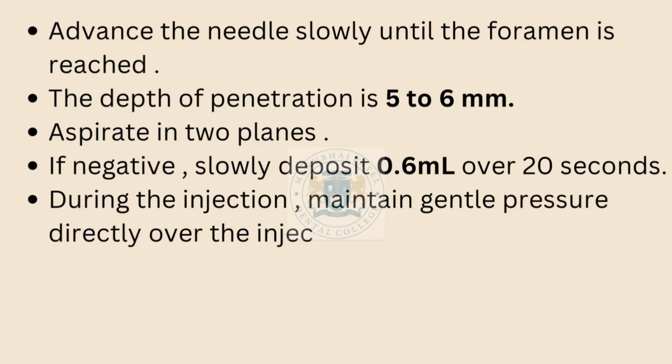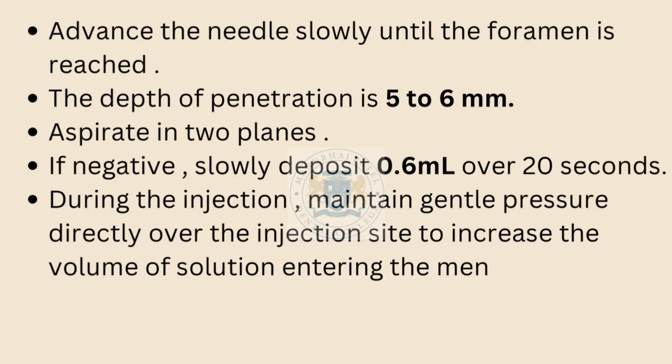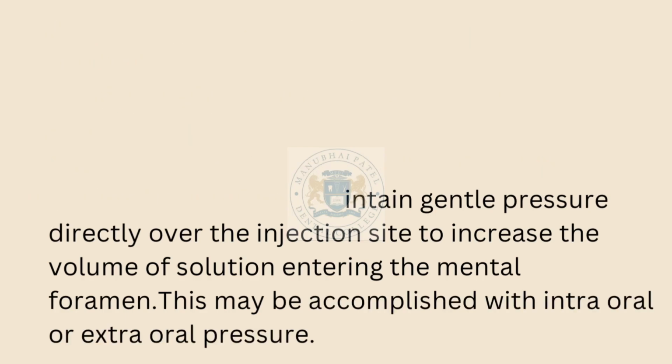During the injection, maintain gentle pressure directly over the injection site to increase the volume of solution entering the mental foramen. This may be accomplished with intraoral or extraoral pressure.